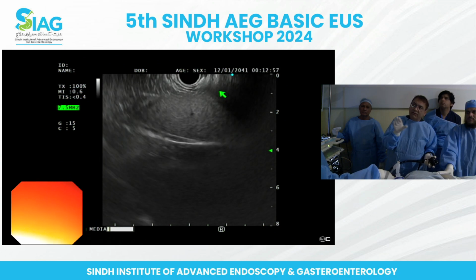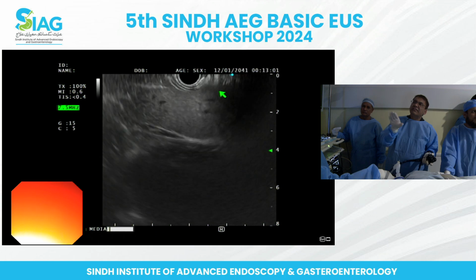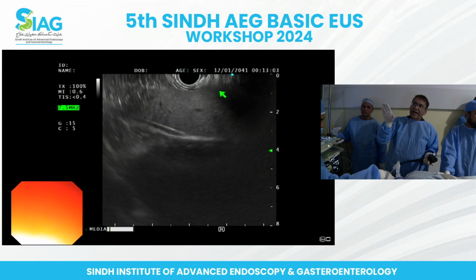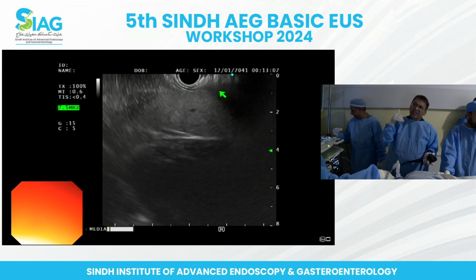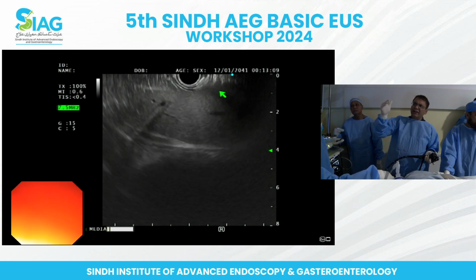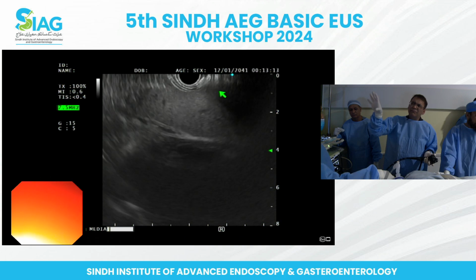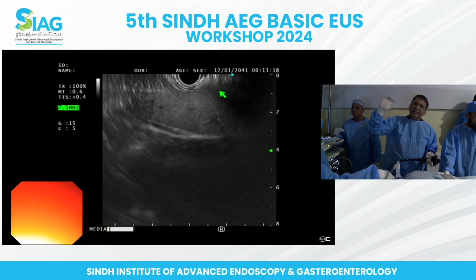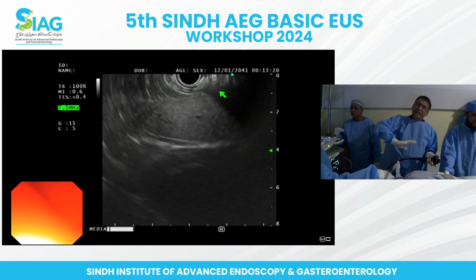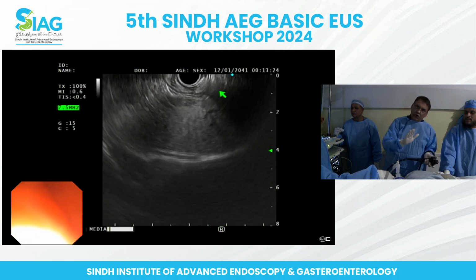The right lobe of the liver, however, you can see completely from the duodenal bulb. That would be both right anterior and right posterior. Keeping in mind the good penetration of these ultrasonic waves is up to 4 or 6 centimeters. So you may not be able to scan the whole liver completely, but for pretty much every segment you can see a good portion of it.